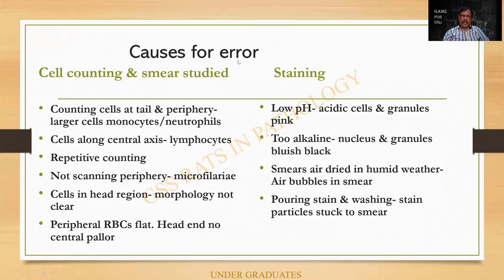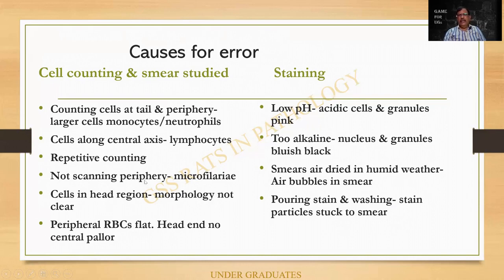There are some causes for error when we count. Counting cells at the tail and periphery — the larger cells will be repeatedly counted. If I count cells only along the central axis, lymphocytes will be over-represented. Repeated counting can cause mistakes. Not scanning the periphery is also an error. In fact, I am supposed to scan the slide under low power or even high power to rule out parasites such as microfilaria.